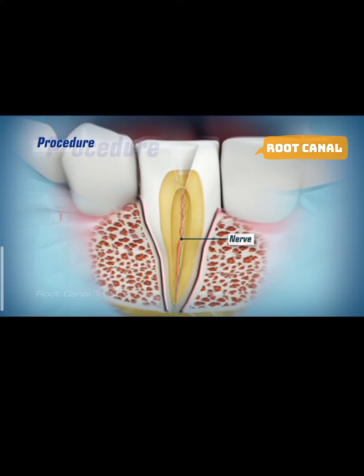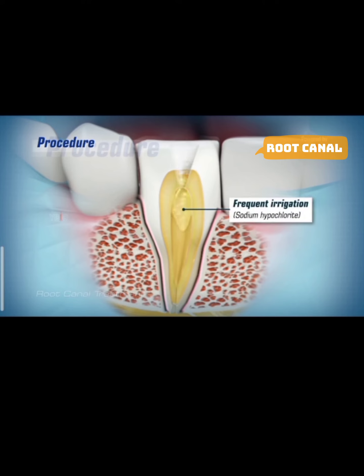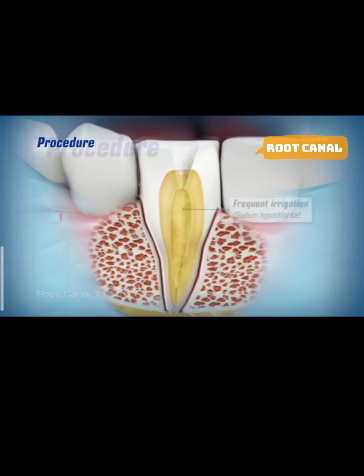It is necessary to remove the entire nerve in order to prevent reinfection and toothache after the procedure. Frequent irrigation of the root canals is done using sodium hypochlorite to flush away the debris.